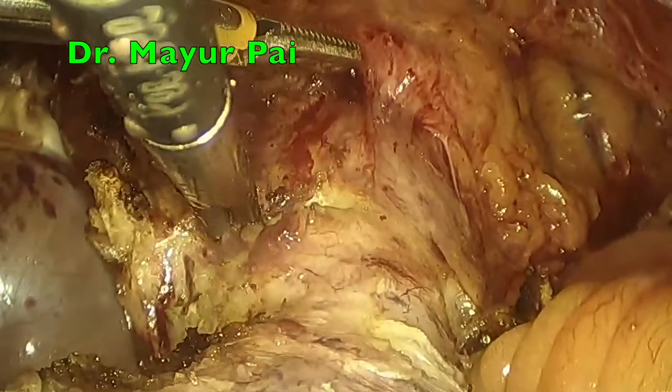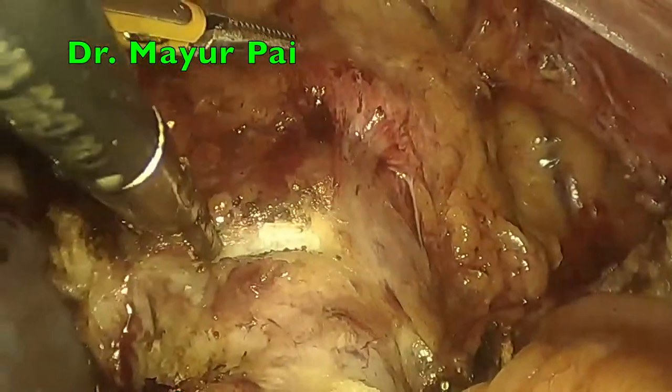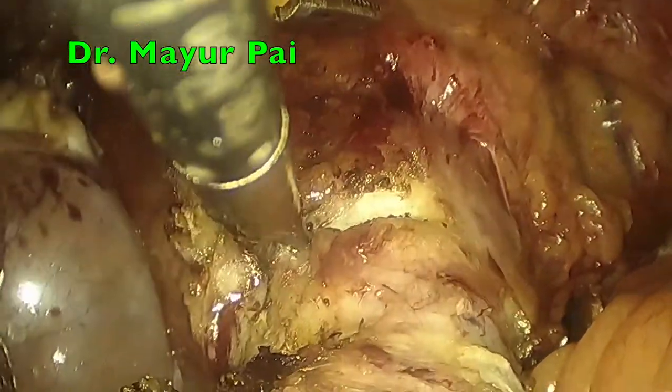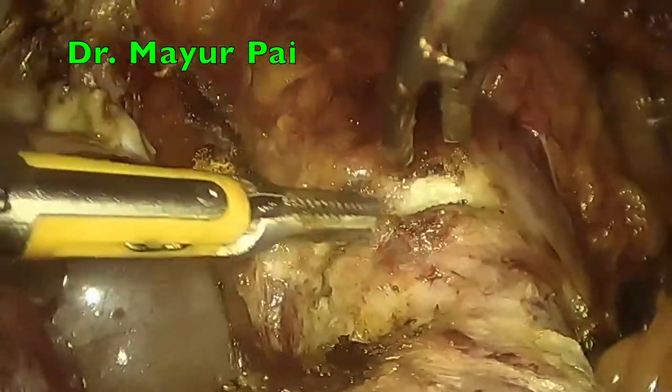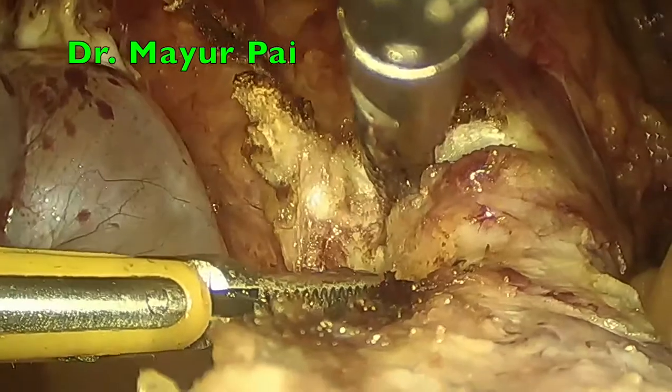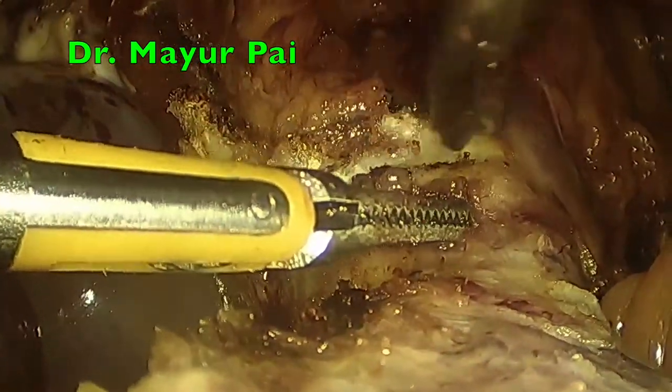Now on your screen you can see that we are giving a cut, which is cutting the cervicovaginal fascia. This helps in further downward mobilization of the bladder, and also this very step will give us a lot of help while suturing the vaginal vault.